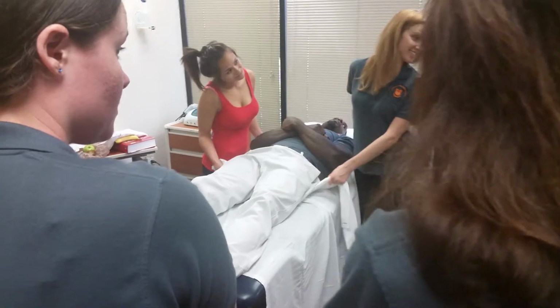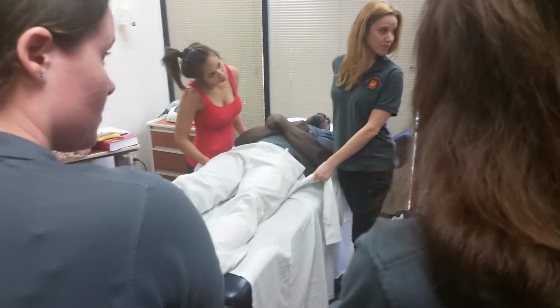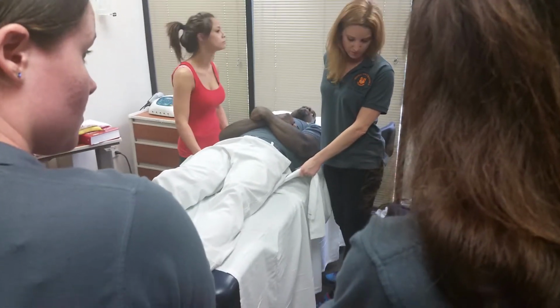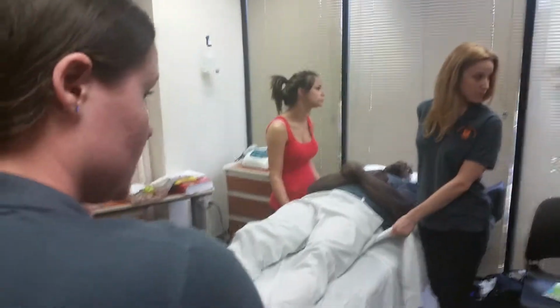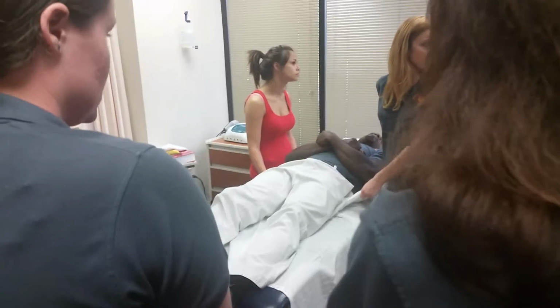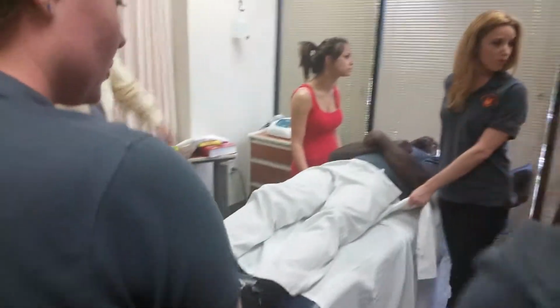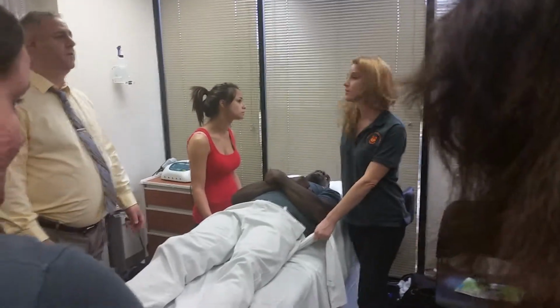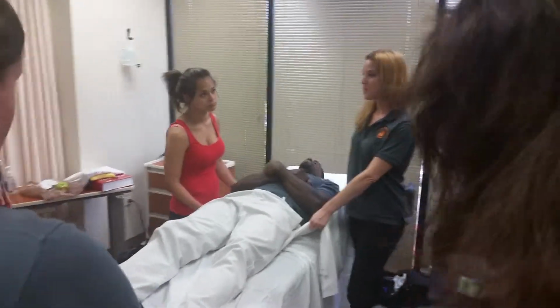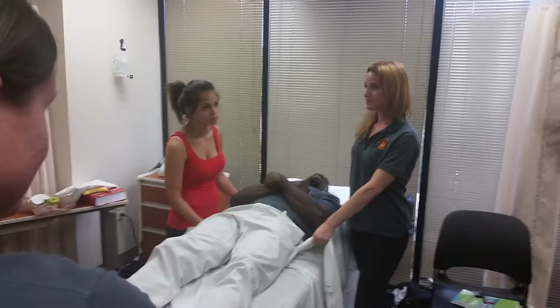I do kind of want to point out, I think it's going to be much harder on this mat because the sheets are not going to slide. I think the friction is high, so I think you're going to really struggle. That is true. So I don't know if I would have you guys do it as hard as you can because you might hurt yourselves. Well, try and see if you hurt yourself.